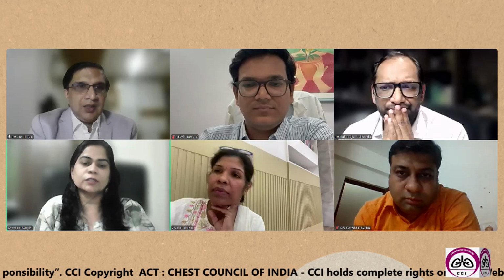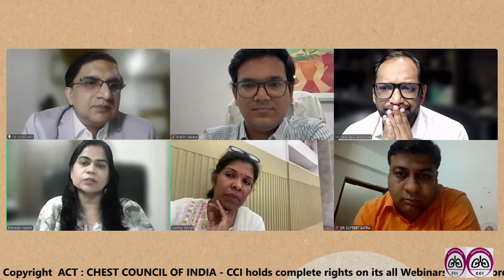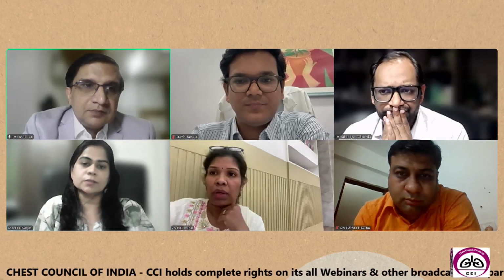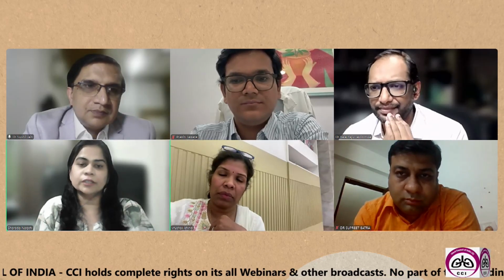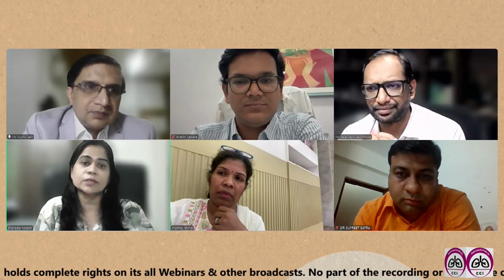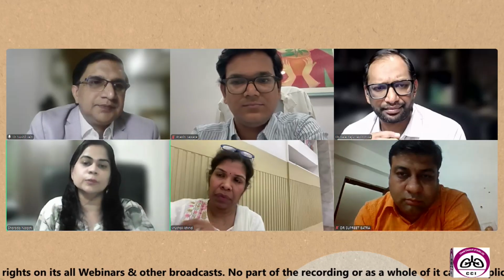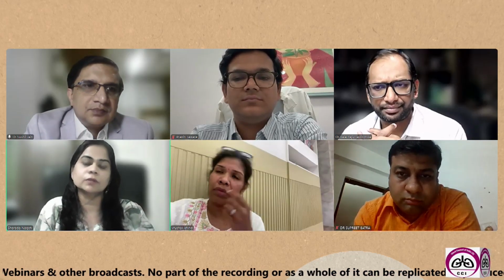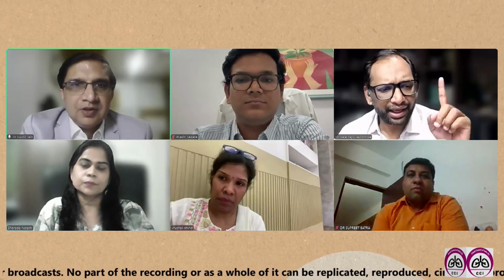Another point I would like to make with regard to this is if the patient already has a diagnosis, even that has to be communicated to the pathologist. Suppose the patient is already a diagnosed case of adenocarcinoma, and the material now is taken, the EBUS is done mainly for molecular testing. Even that has to be communicated so that the pathologist will not do additional immunomarkers because the diagnosis is already established and all the material can be sent for molecular testing. Okay, thank you. That's an important message. I have a question.